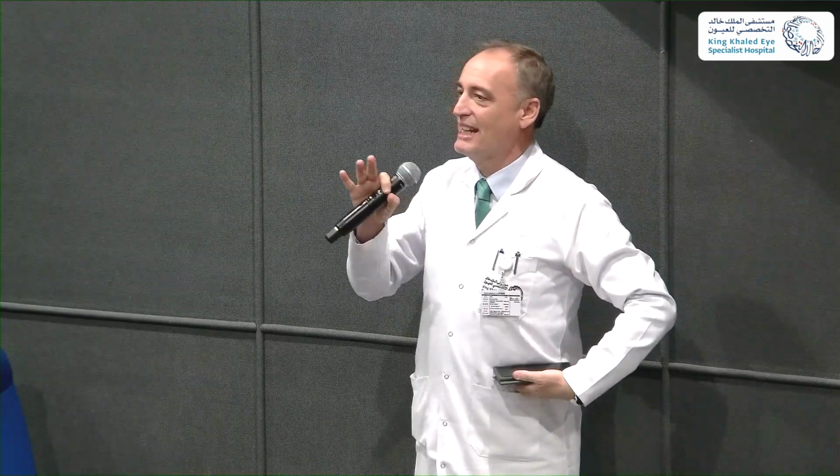What I like about the lecture of Dr. Ramzi is that it highlights that it depends on the case, it depends on the patient, and it depends on surgeon training. Because when we talk about surgery, I really don't like to put in general questions. It depends on your training. If you are well trained in buckles, do buckles. You will do much better. If you try to do a vitrectomy and you don't know how to do it, that's a problem. If you are trained in pneumatic retinopexy, do it.